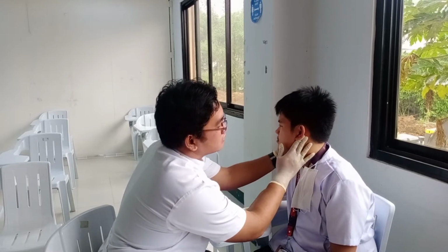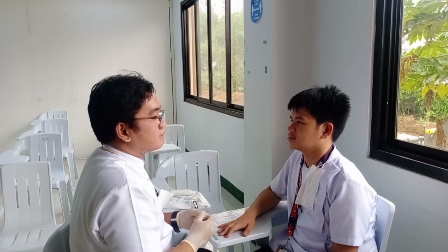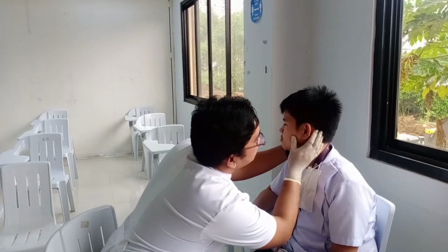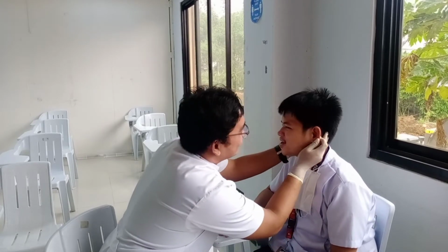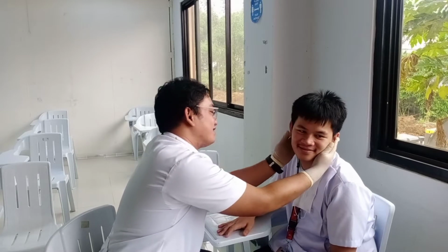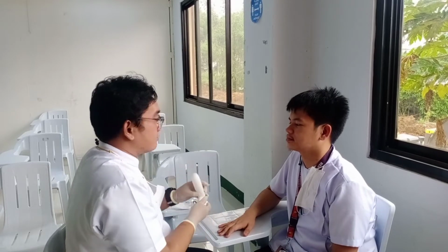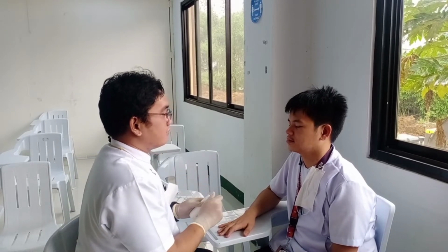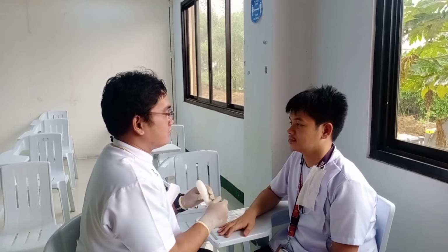Inspect the external ear canal for cerumen, skin lesion, pus, and blood. This is to determine the color and texture of the cerumen and to check for any drainage. Using the otoscope, inspect the tympanic membrane. This is to visualize the tympanic membrane. Attach the speculum of the otoscope with the diameter that will fit the ear canal without causing discomfort. This is to achieve maximum visualization of the entire canal and tympanic membrane.